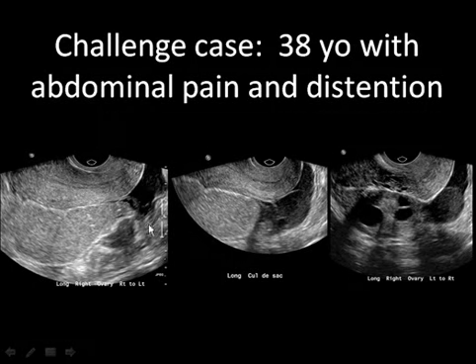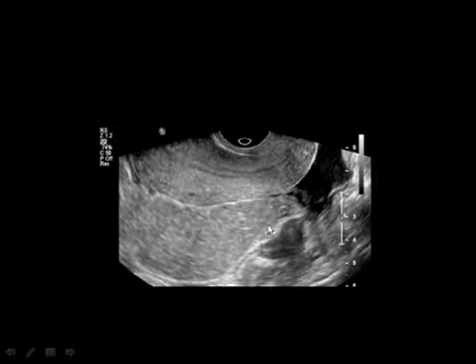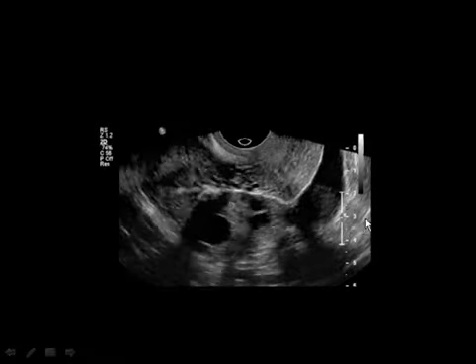As we scan towards the adnexa, we see perhaps a cystic structure in this area, and further to the right, we see the right ovary with a cystic structure adjacent to it. Cine shows the right ovary, the cystic structure, and this dilated tube that is coming to a point where we see this cyst with low-level internal echoes.